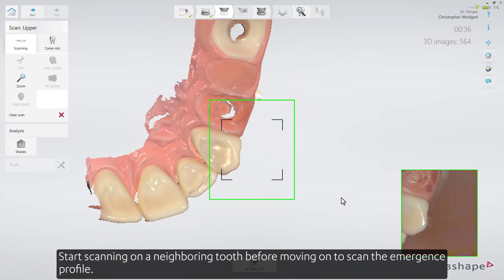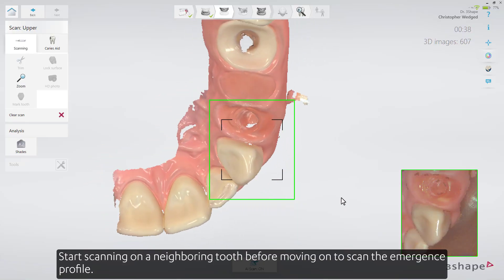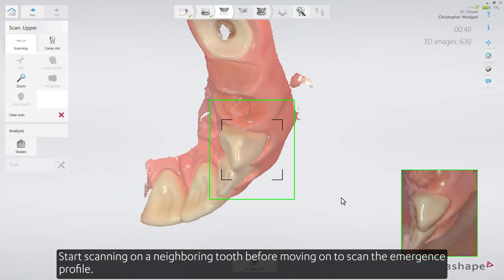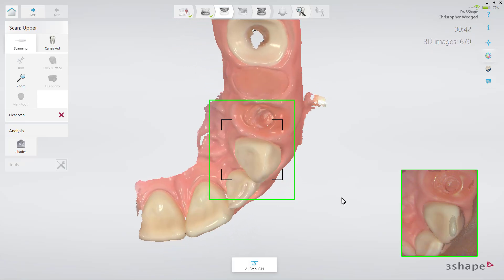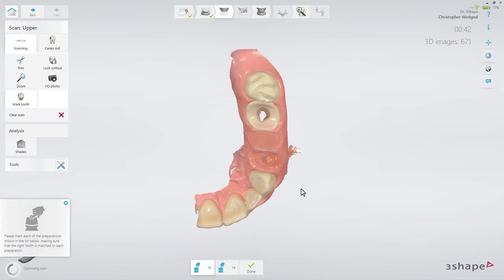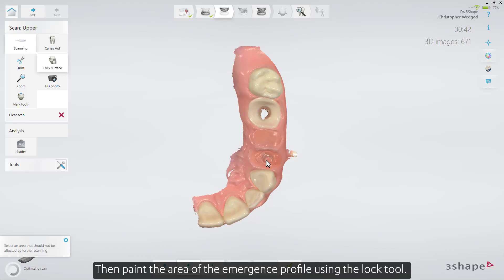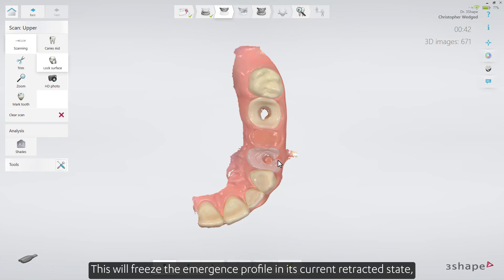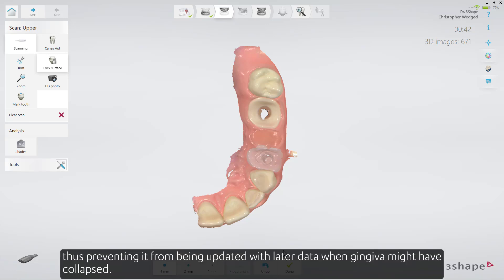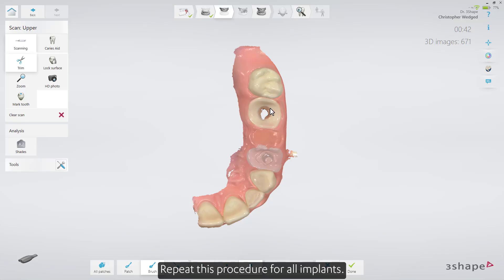Start scanning on a neighboring tooth before moving on to scan the Emergence Profile. Then paint the area of the Emergence Profile using the Lock tool. This will freeze the Emergence Profile in its current retracted state, thus preventing it from being updated with later data when gingiva might have collapsed. Repeat this procedure for all implants.